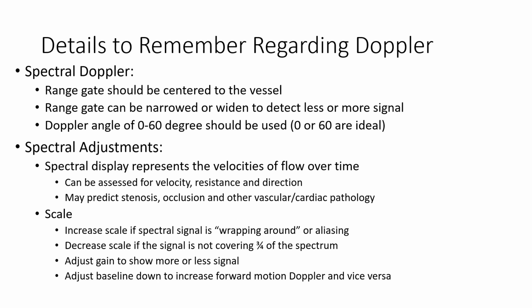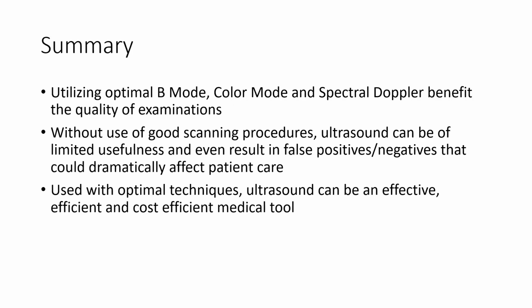You can also use gain to provide more or less signal of the Doppler, of the spectral signal as well. So increasing your overall gain would increase the brightness of the signal on your spectral analysis, whereas decreasing it would take some of that data away.